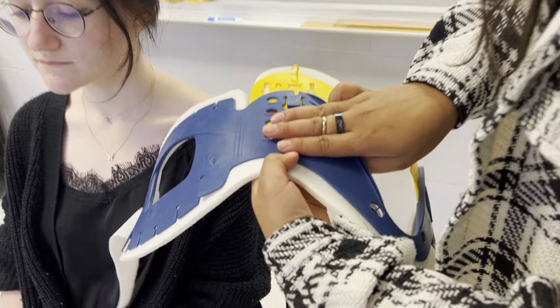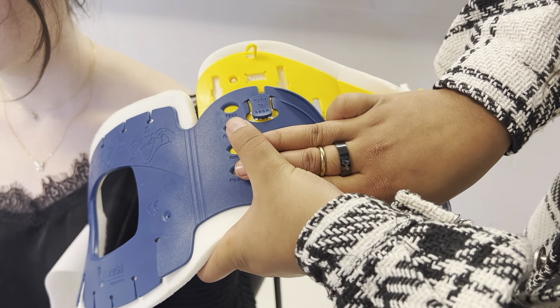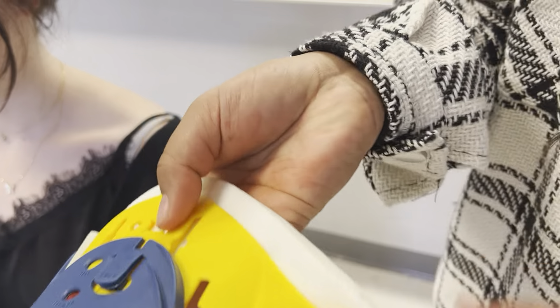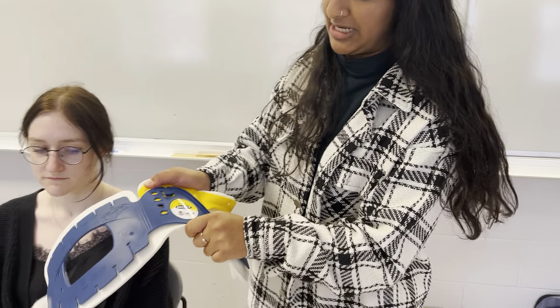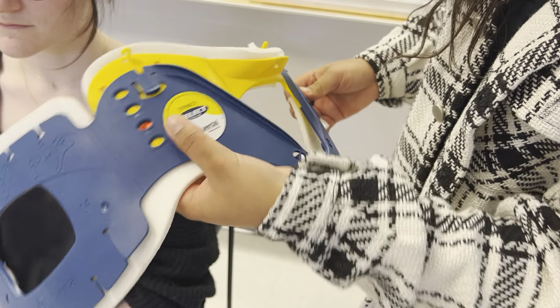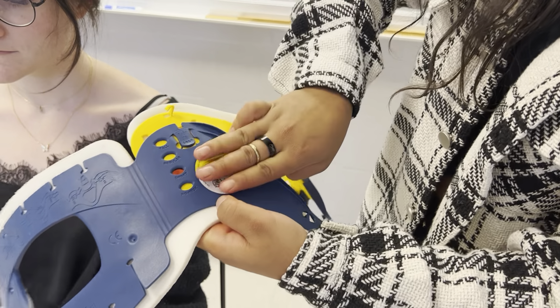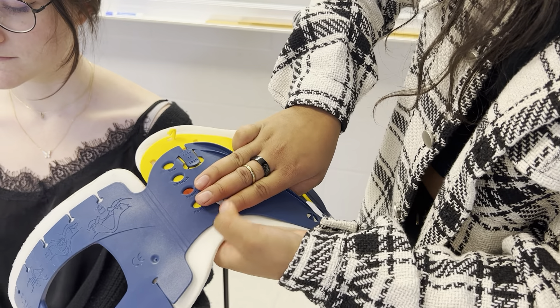I'm going to take my fingers and put them right there. With my three fingers from the bottom, I can see that where the red is at 'regular' is too big. So I need to pull it down. The way I pull it down is I pop out the tabs where it locks, push it down, and make sure both sides are set to 'short.' Then I push my tabs back in. Measuring again, from the bottom to the top, I am now at bottom to short.